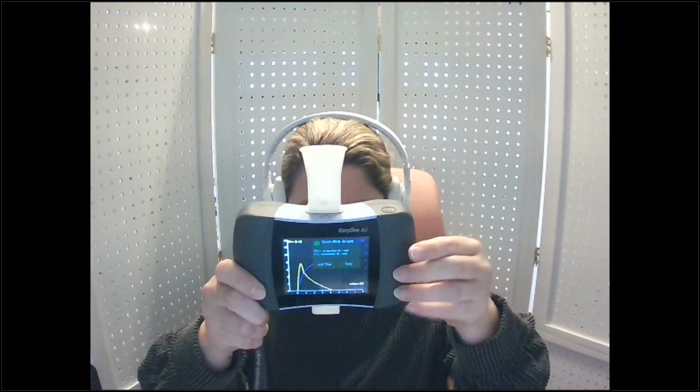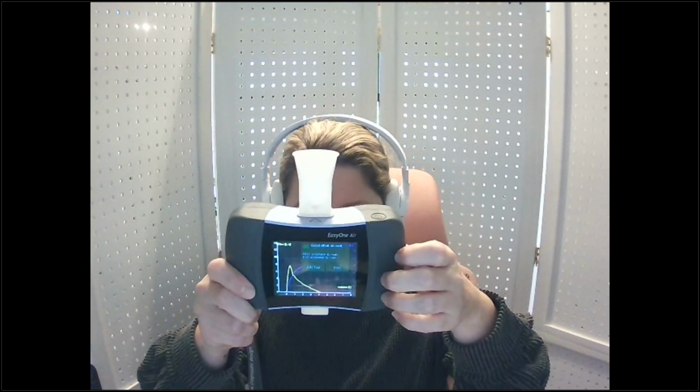We're going to talk a little bit about acceptability for each individual trial versus the session overall here in just a moment. I'm going to do one more demonstration before we do that though. I have two different options. It's asking me to add another trial or to view the data. So we can view the data at any time.